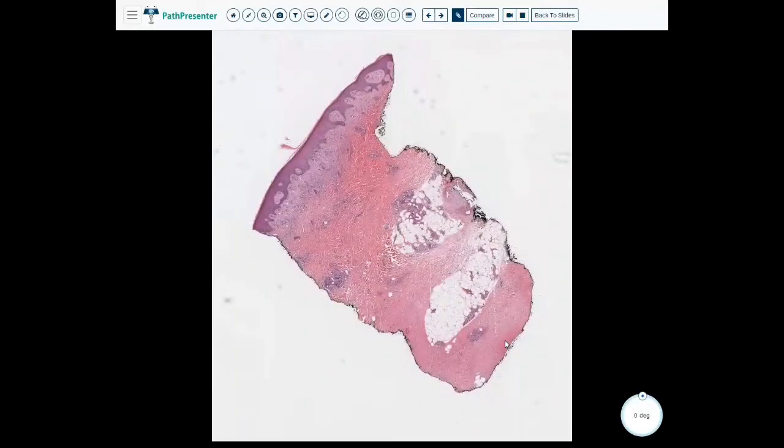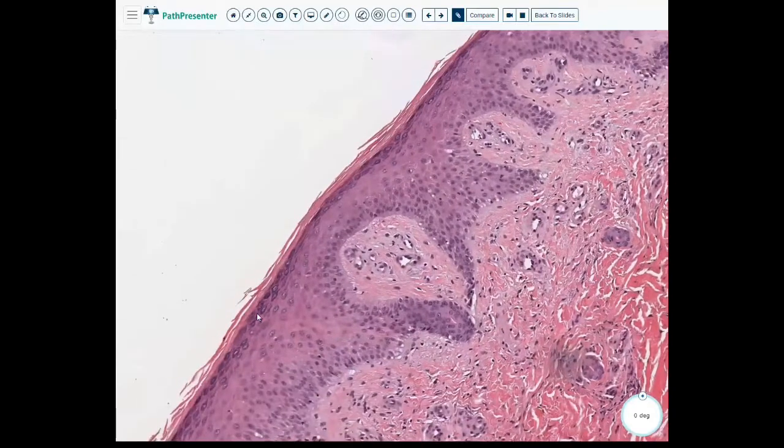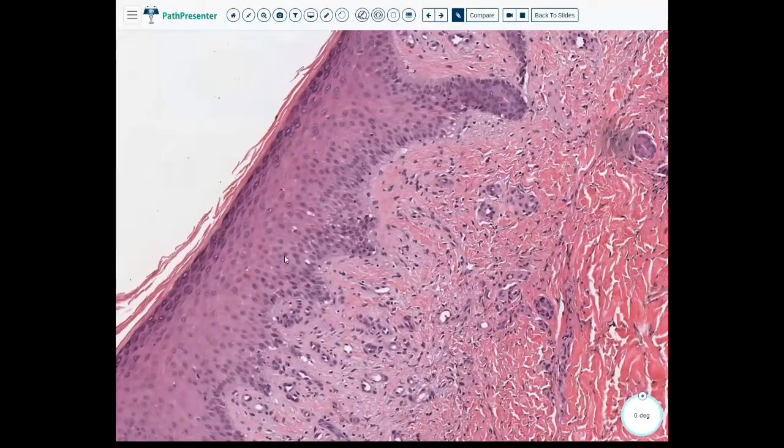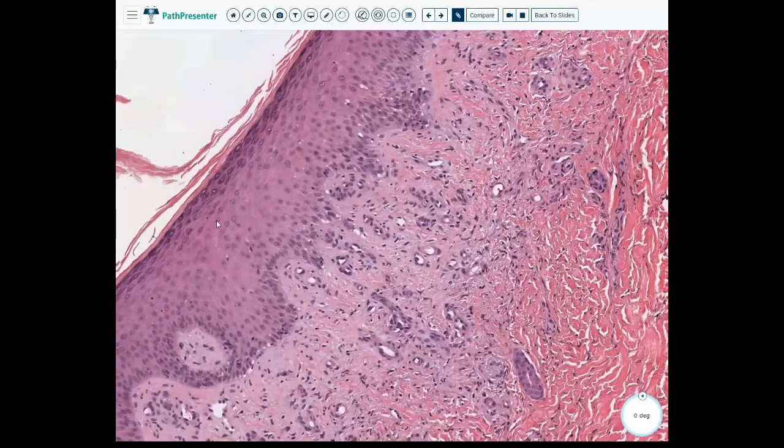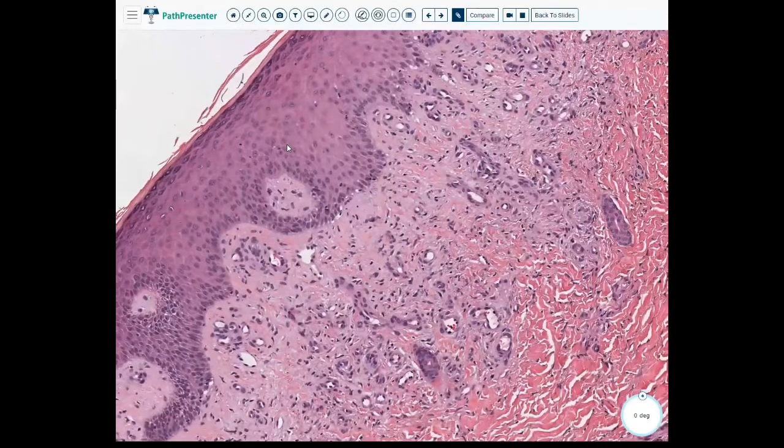Case 2, we have our dermis. Sorry, our dermis is relatively bland looking at low power. And again, it seems to be that we have our superficial or papillary dermis seems to be the focal point. We have a little bit of acanthosis again. So if we zoom in, again, we see the keratin layer and granular layer all look fine. There is some acanthosis, intact basilar layer, and nothing else too remarkable going on in our epidermis.